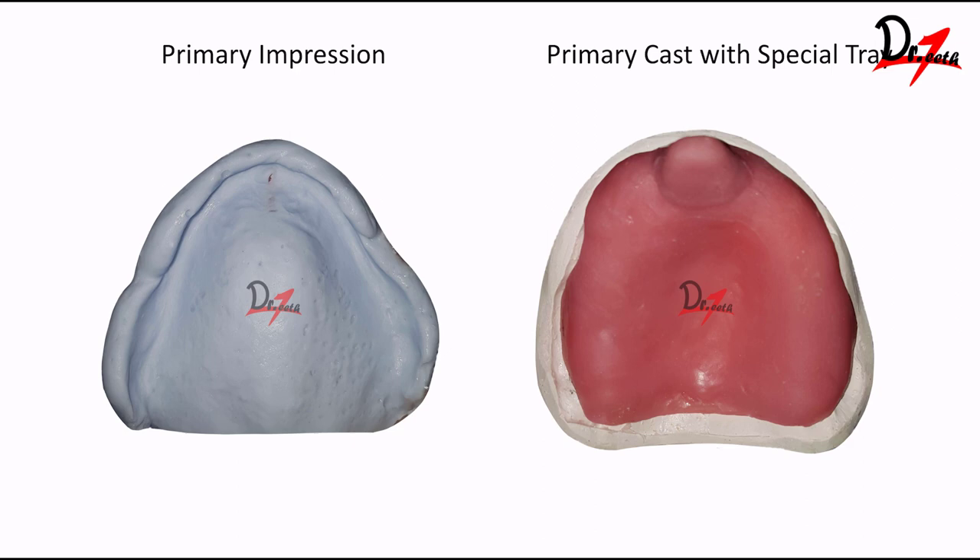Primary impression was taken using alginate. We used the old denture of the patient to take the impression. The drawback of alginate for edentulous ridges is that the flanges are not properly recorded because it is not a muco-compressive material. But in this case, since we had the old denture, it acted as a custom tray and we were able to get a proper sulcus. Then the primary cast was made with a special tray.